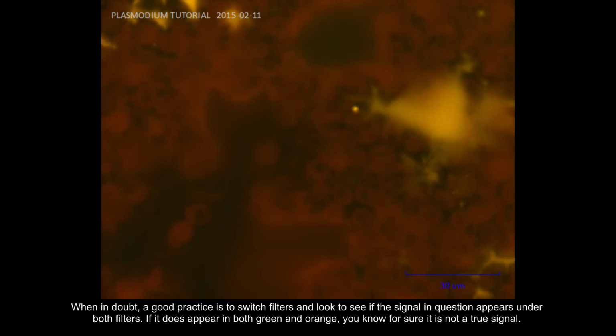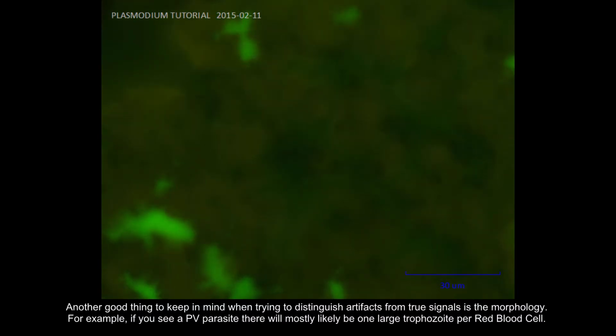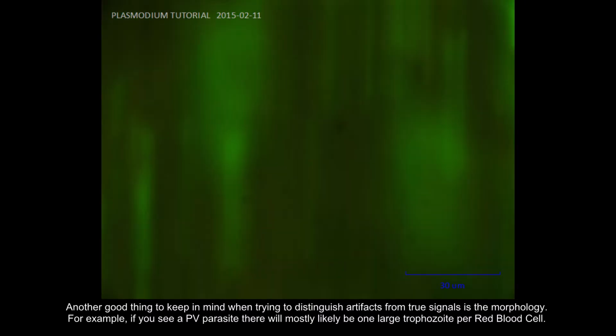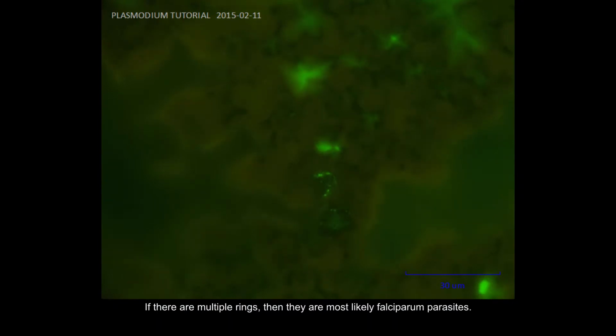When in doubt, a good practice is to switch filters and look to see if the signal in question appears under both filters. If it does appear in both green and orange, you know for sure it is not a true signal. Another good thing to keep in mind when trying to distinguish artifacts from true signals is the morphology. For example, if you see a PV parasite, there will most likely be one large trophozoite per RBC. If there are multiple rings, then they are most likely falciparum parasites.